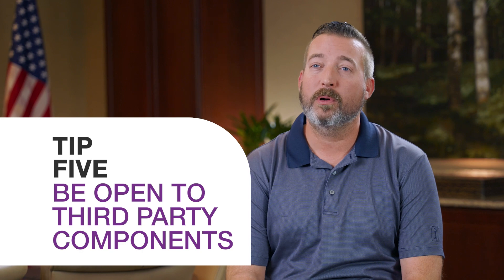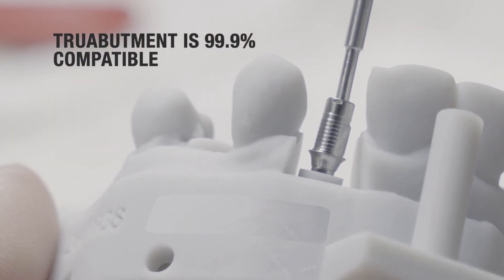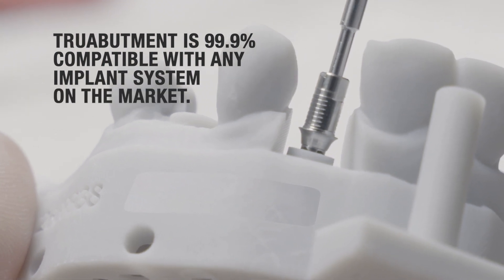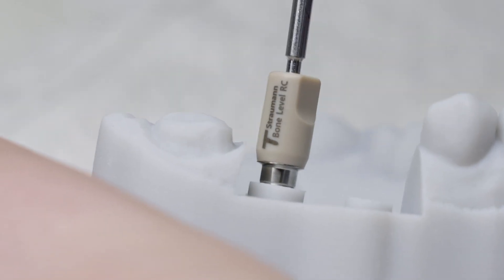Which leads me into tip number five: don't be afraid of third-party components. True Abutment is 99.9% compatible with any implant system on the market, which makes our workflow a lot easier. Make sure you speak with your dental technician about what is compatible and what's not. This is going to be key to making sure that your crown is delivered successfully.